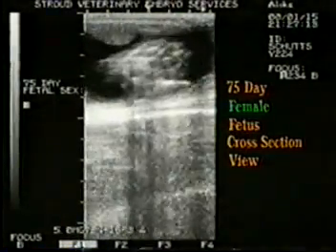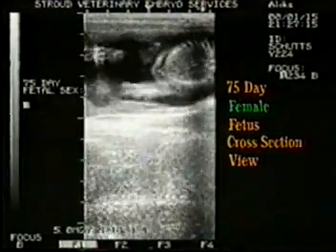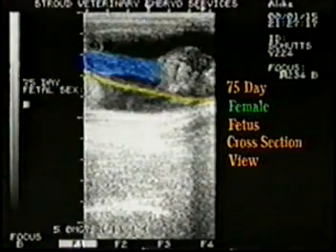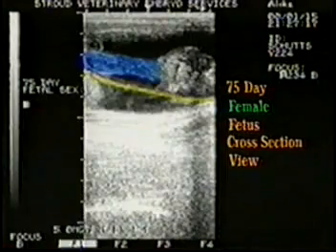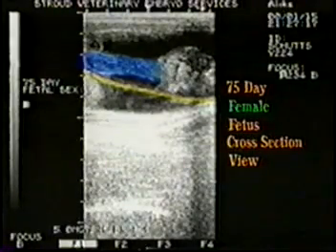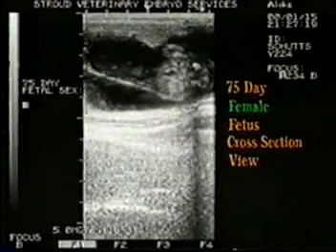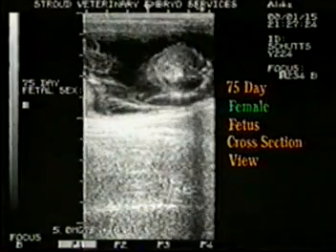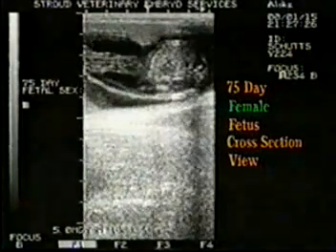The subject is now a female fetus. The umbilicus is highlighted blue. The yellow line represents the edge of the amniotic vesicle. Moving to real time, look closely at the point of attachment of the umbilicus to the abdomen. Notice the lack of a male GT or penis.